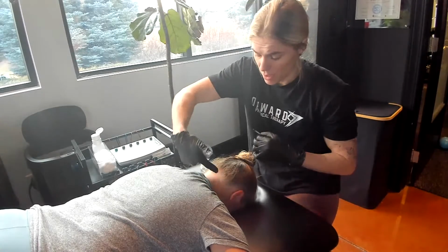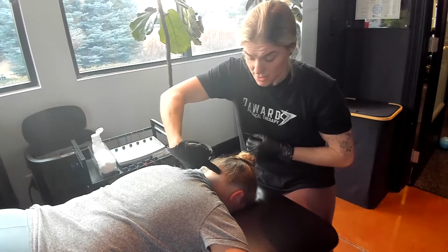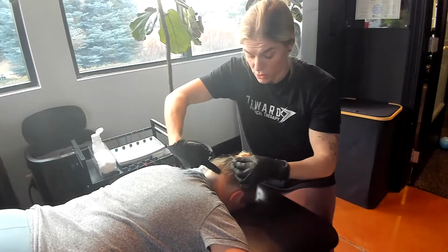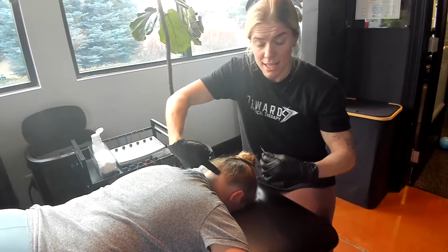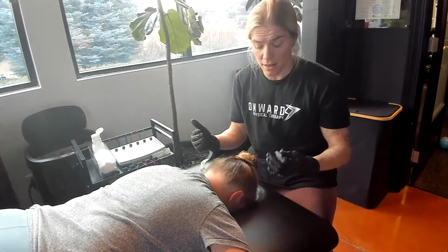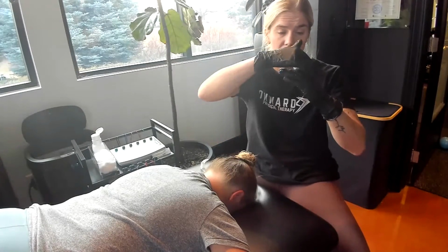So if we're thinking about the needle angle is like so. For upper trap, we're thinking about angling that needle almost towards the eyeball on that ipsilateral side of that muscle. For the semispinalis, it's a little bit more lateral. The occiput is diving, again, anterior.